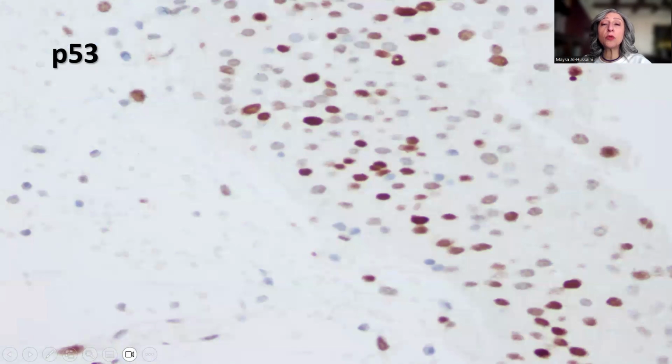P53 showed this beautiful mosaic pattern of staining, with some tumor nuclei positive strongly, others positive weakly, and yet others completely negative. The Ki-67, of course, was increased because we could see some mitotic activity. However, most of it is really confined to the basal and parabasal layers of the urothelium.